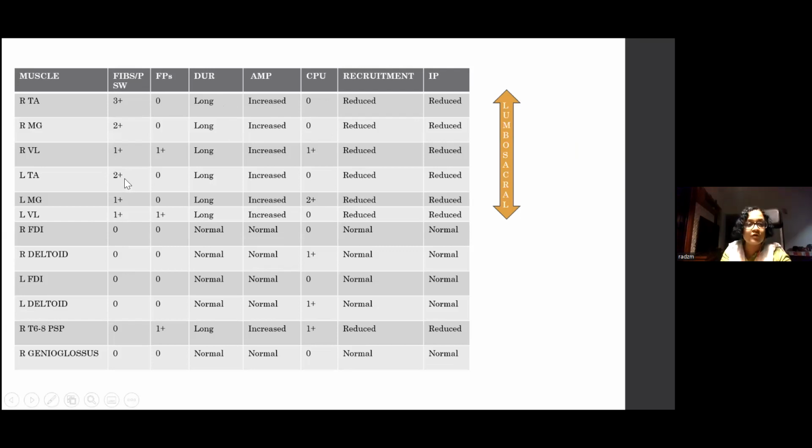So the clinically uninvolved side is also affected. So that has a high predictive value for possible motor neuron disease. The next thing you find is your thoracic. So the moment you see bilateral denervation in somebody with unilateral symptoms in one segment, like this lumbosacral segment, you have to move a segment above to try and find out if there's denervation there.